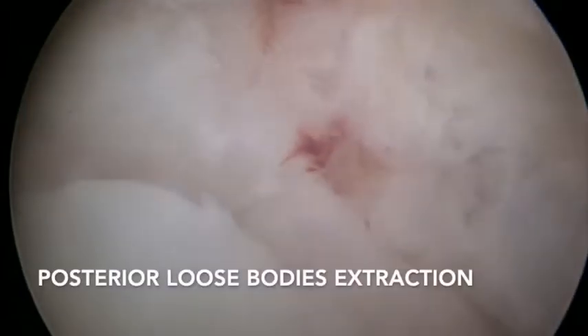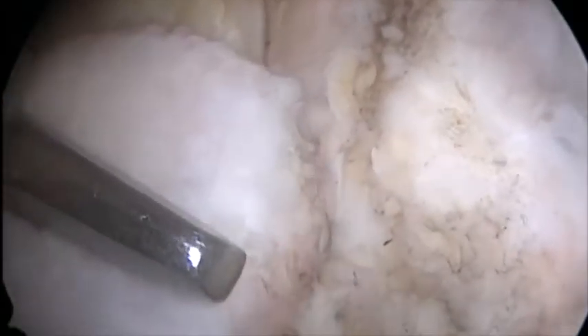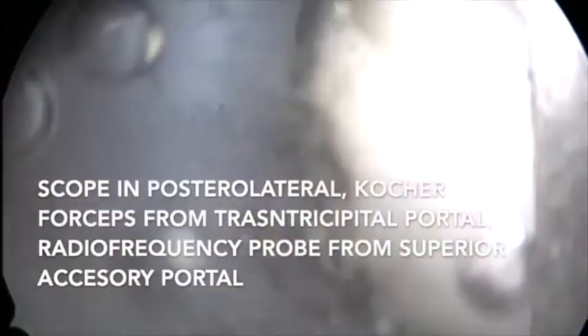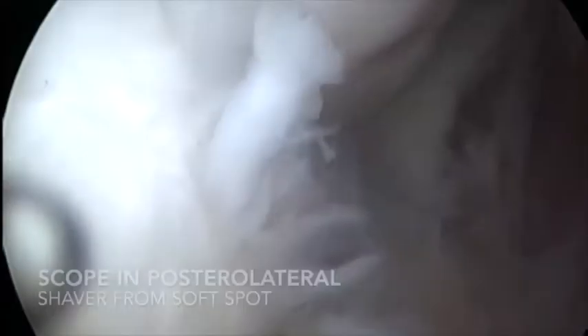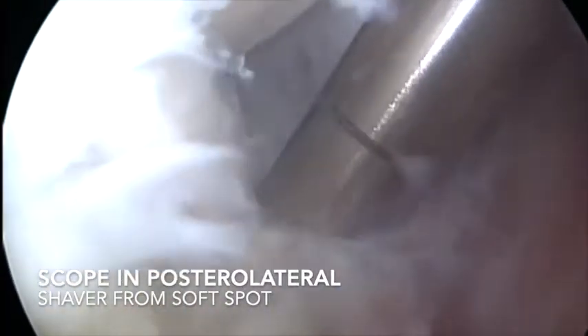Then we moved to the posterior chamber of the elbow, using the transtricipital portal and the posterolateral portal to extract all the loose bodies located in the posterior part of the elbow. We also made an accessory transtricipital portal more proximally, as well as a soft spot portal.